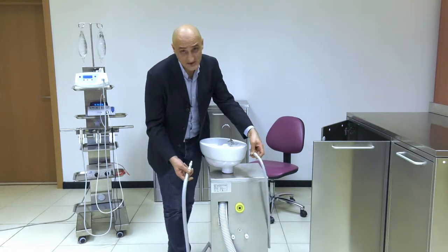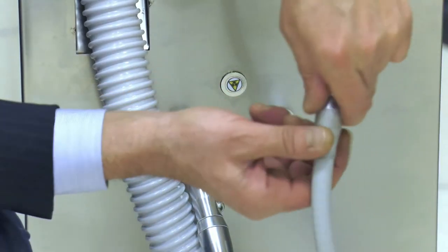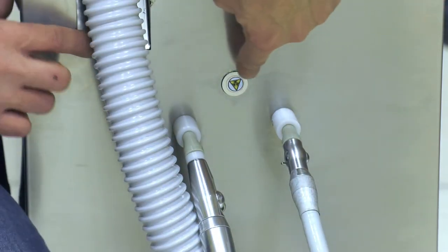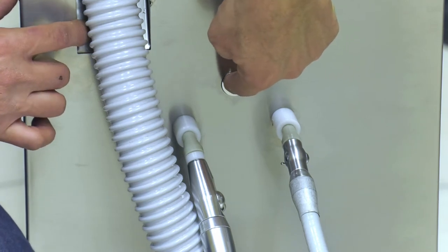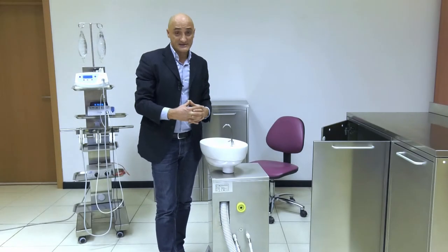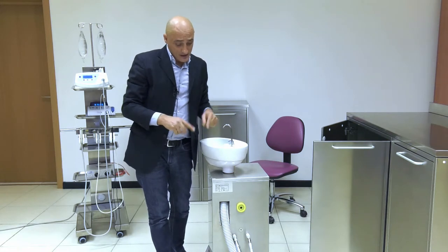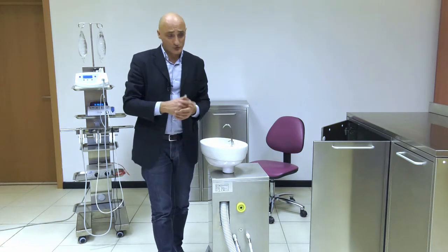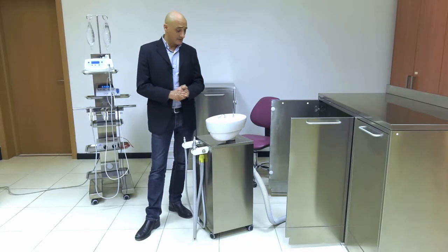To do so, insert the cannulas and then press this button for 15 to 20 seconds. There is a small tray inside containing a disinfectant mix that is collected by the cannulas and flows through the whole suction system to clean it.